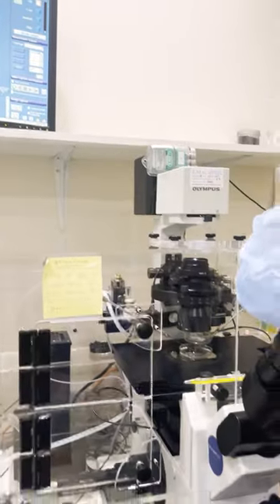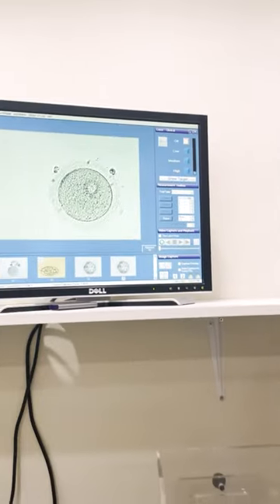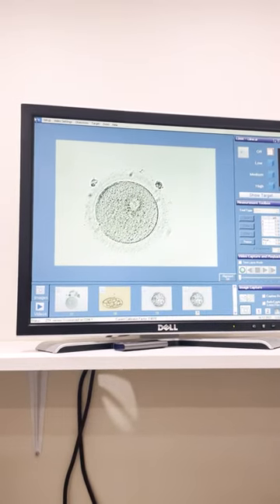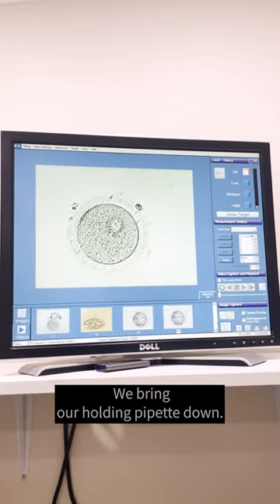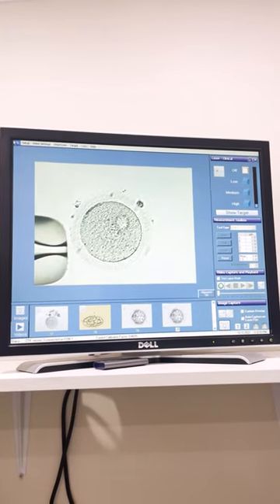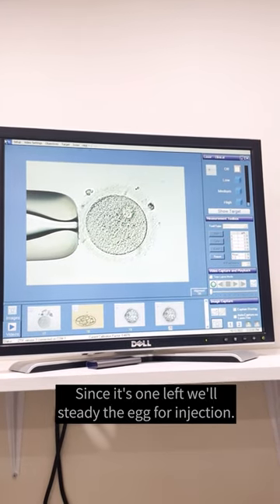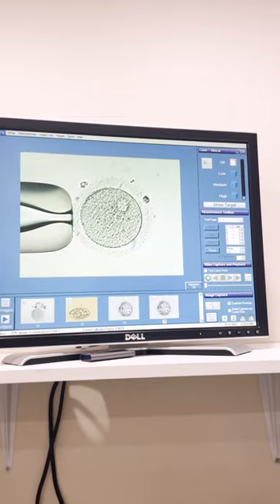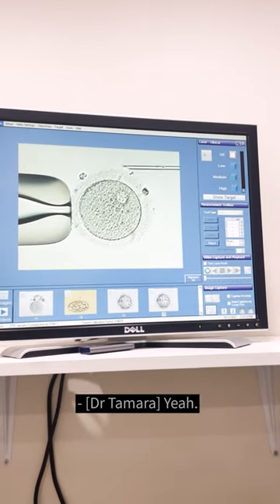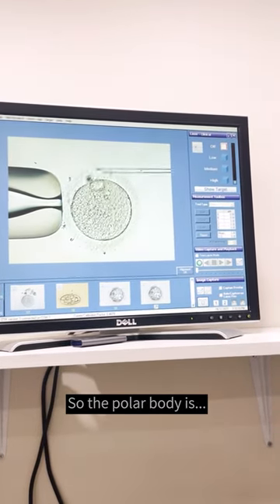And we find our egg — beautiful, not a bad looking egg. So we're going to bring our holding pipette down. This is the one that will steady the egg for injection. Bring our injection pipette down with the sperm.